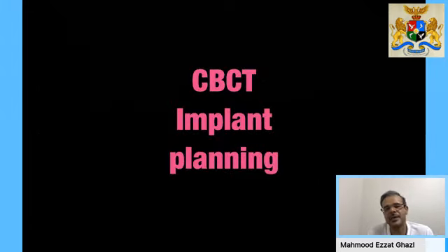So the next part is looking at the CBCT, the patient's bone, and starting at the end our implant planning. So step number one, as we said before, bringing in the face, the aesthetic proposal. Step number two, bringing in the intraoral scan, doing the digital wax up according to the aesthetic proposal, adjusting function. Step number three is bringing in the CBCT, registering the CBCT on top of each other every time. So every time I bring in new information, it's not a new plan. It's a continuation of the plan.